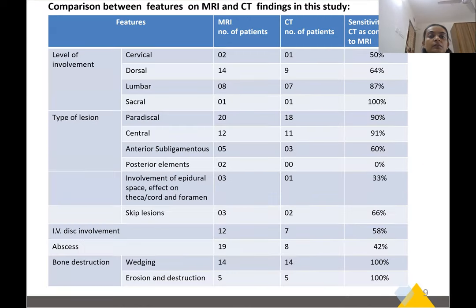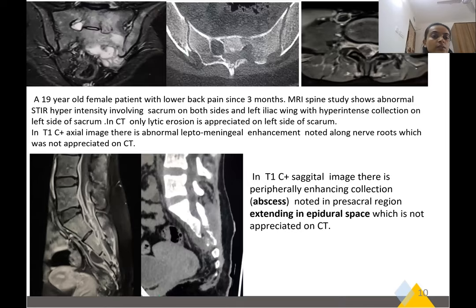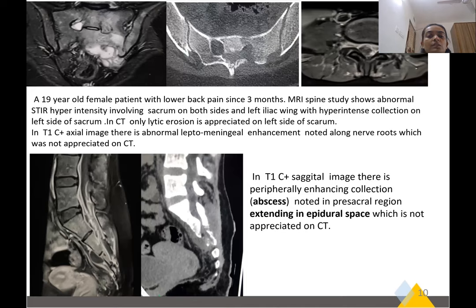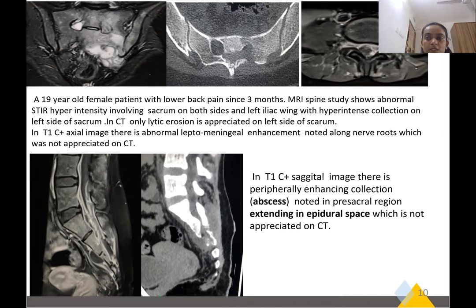Here is a comparison between the MRI and CT findings of the various patients. A 19-year-old female patient with lower back pain for three months: MRI spine shows abnormal STIR hyperintensity involving the sacrum on both sides and left iliac wing, with a hyperintense collection on the left side of the sacrum. On CT, only lytic lesions were appreciated on the left side of the sacrum. On MRI axial contrast imaging, there is involvement spread along the nerve roots. On T1 contrast sagittal image, a peripheral enhancing collection and abscess noted in the pre-sacral region extending into the epidural space, which is not well appreciated on CT.